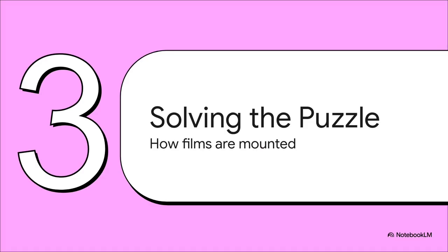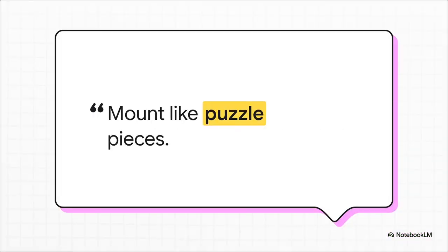Okay. So all the little pictures have been taken, one by one. But now comes the next big challenge, putting them all together. You can end up with a full set of like 18 or even more of these little films, and someone has to arrange them into a perfect, coherent map of the entire mouth. The training manuals for dental professionals have this perfect, simple instruction for this part. It just says, mount like puzzle pieces. And that's exactly what it feels like.